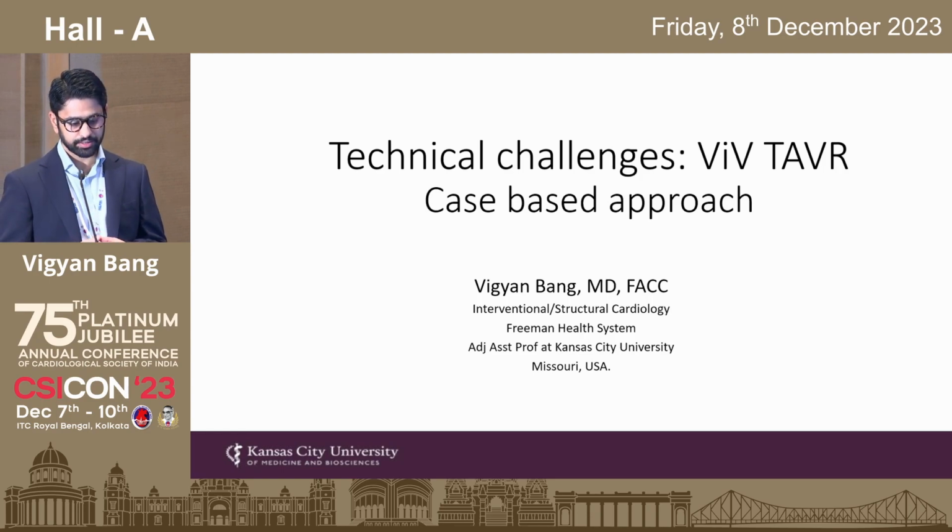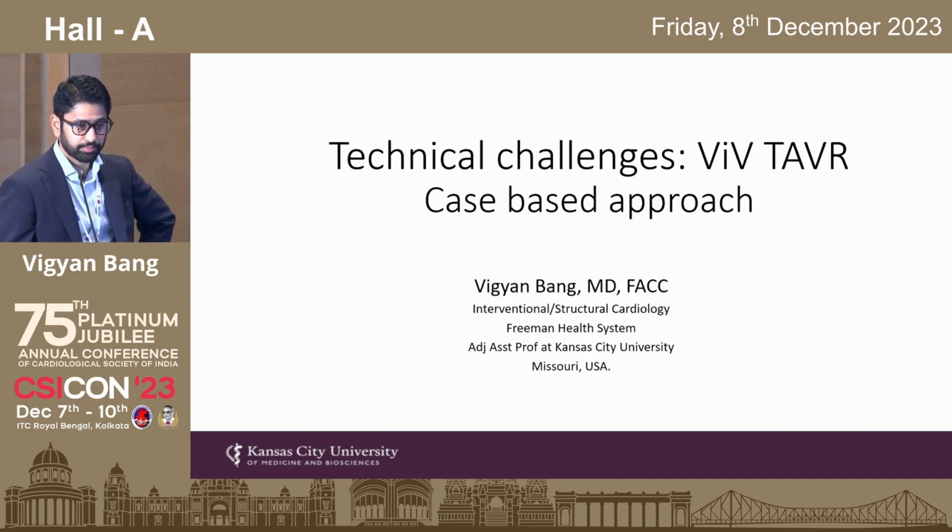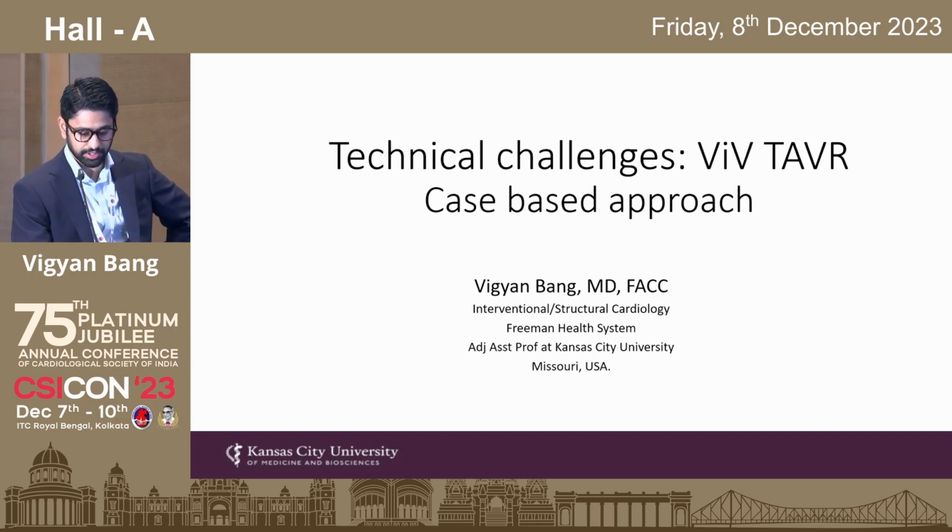And we all understand that we need to predict the risk of coronary obstruction, assessing valve to coronary distance, looking for the risk of sinus sequestration, using BASILICA in some cases to mitigate that risk, thinking about patient prosthesis mismatch, using fracturing of the valve to optimize gradients and valve performance. So instead of belaboring those points, I thought I'd use a case-based approach to show some of the toughest cases I've had over the past year to see what some of these challenges might be.